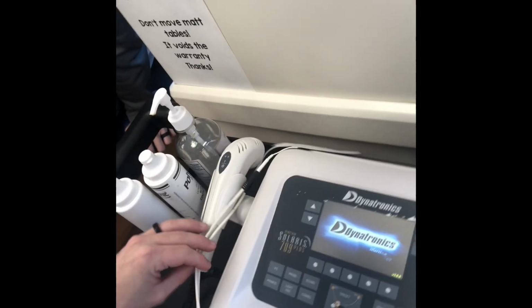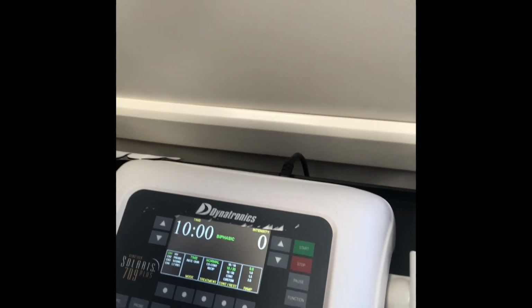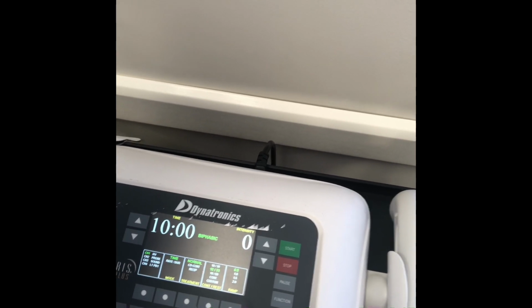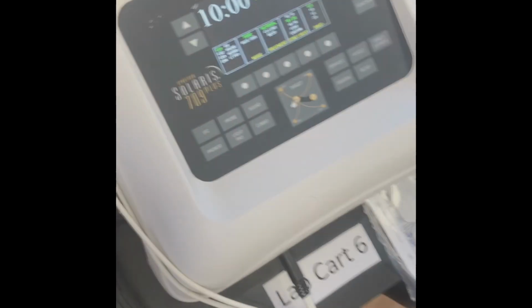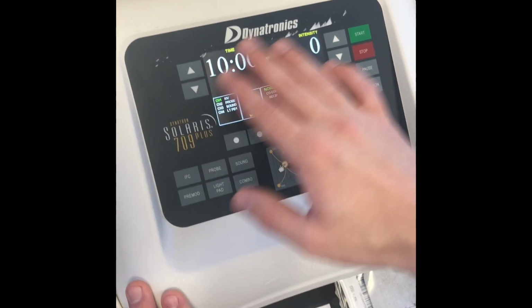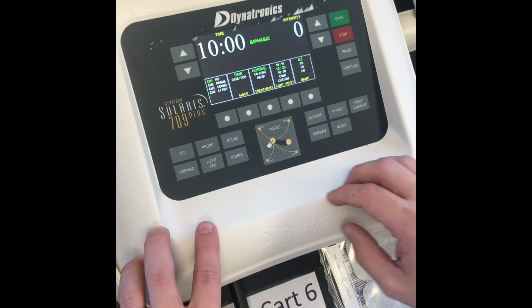So I will now demonstrate how to set up the machine here. I've already got it turned on in the back here, and as I stated before, we're going to do a biphasic current. This machine has some preset parameters. I'm just going to double check them before we start. So I selected biphasic current here, and this machine has preset stuff, but I'm just going to double check and make sure that they're the parameters I want.